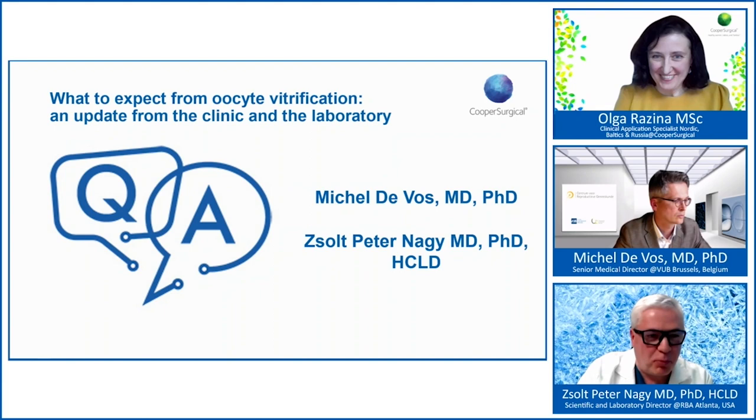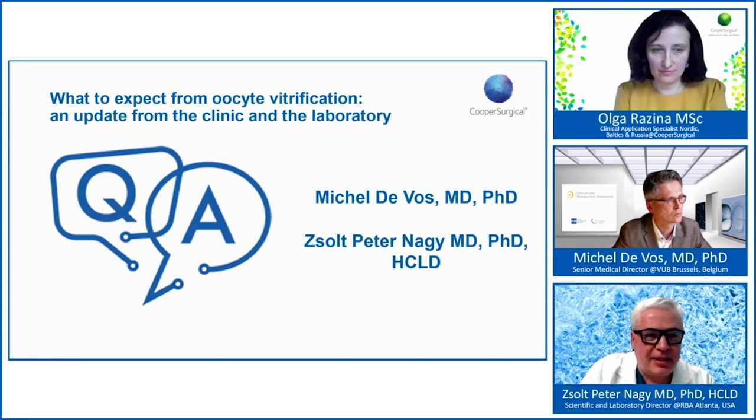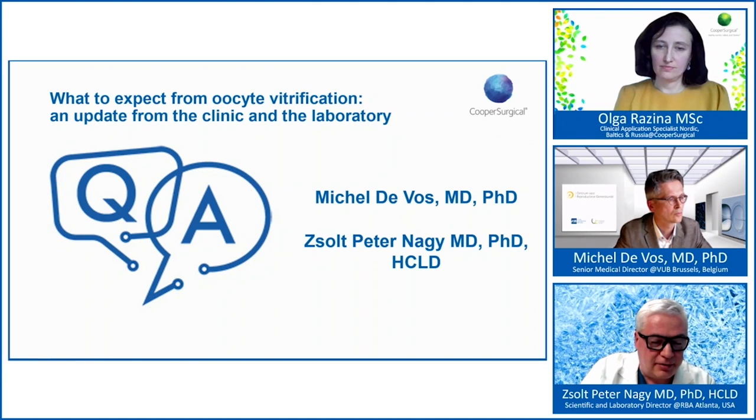Okay, I think everything is important. And when we look at the different protocols from the different companies, the different kits, actually today they are very, very similar to each other. In my opinion, a little bit of the limiting factor is the actual volume of each kit. Back at the time when here at RBA we started to do vitrification, there were not yet kits available on the market, we were preparing our own vitrification solutions. My colleague, Dr. Cheng, was doing that. And because of that, we were able to use much larger volumes for vitrification and also for warming. And we saw some benefits of using larger volumes for both vitrification and warming.